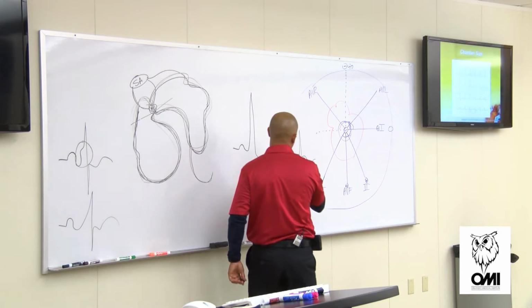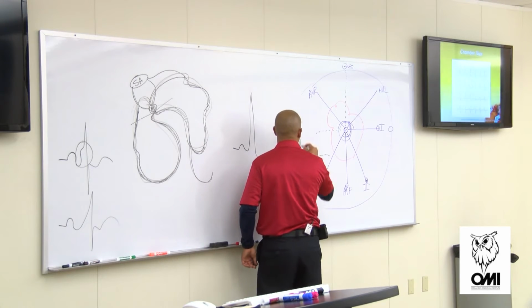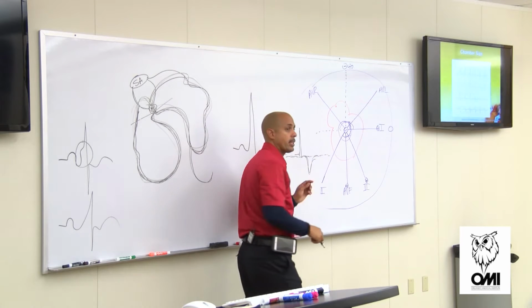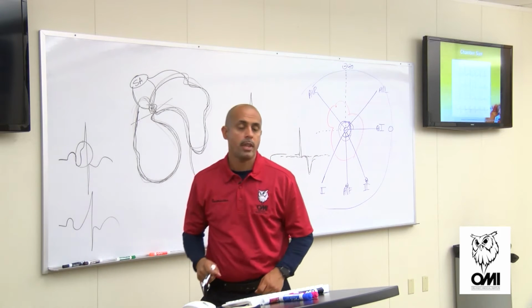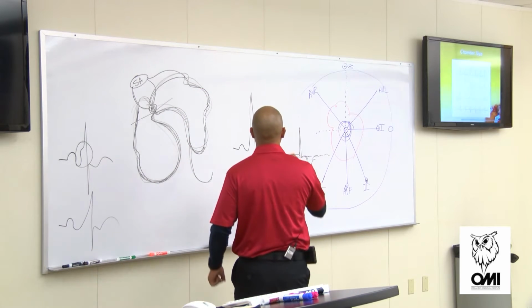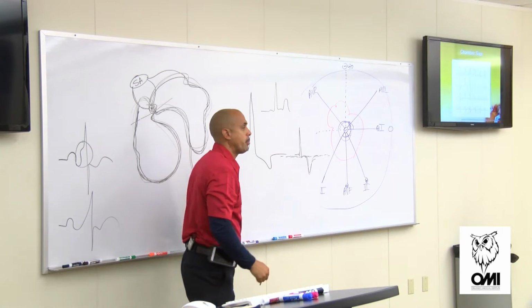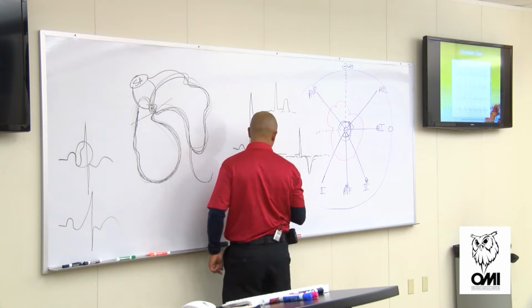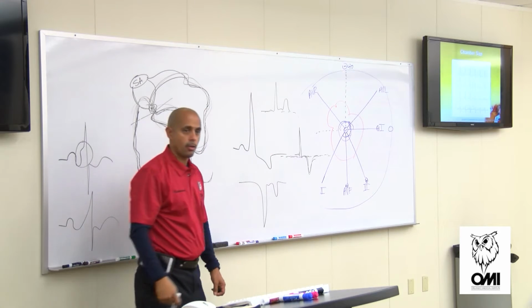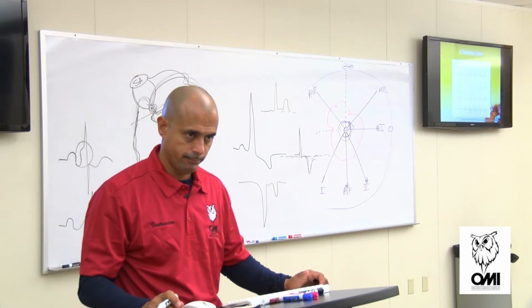Look, once again, I draw, what is this? The isoelectric line, right? R wave QRS is on one side, T wave is on the other. Are we on opposites? We call that discordant. Because if we were like this, what would you call this? Concordant, because we're both what? How about this one? Concordant as well, because we both are what? Same side. Wouldn't that be mistaken for ischemia?